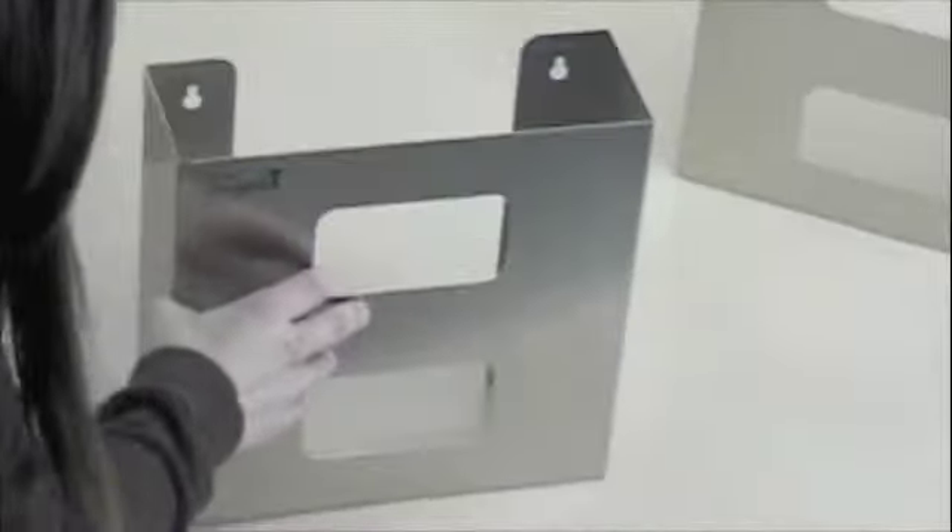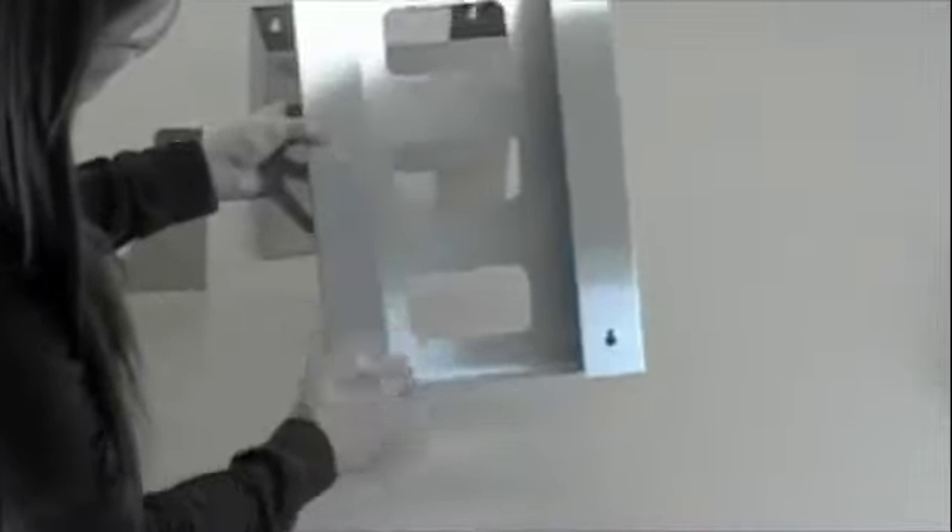In addition, these holders are designed to have a universal fit, so that just about any box of gloves will fit in them. They are designed to not weigh too much — the back is cut away, so that eliminates some of the weight of the holder itself.